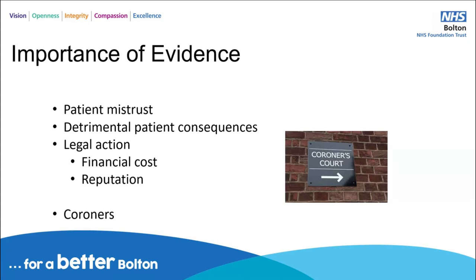And QC material, first party, third party in particular, is a huge piece of evidence and strong evidence that you would want to have in your hand if you were ever called up to coroner's court to justify the decisions that had been made around a test from a clinical point of view. Those are the things that I would be taking and saying, this is the evidence that we have. I made those decisions based on the information that I had, and the information I had was very strong or perhaps very weak.